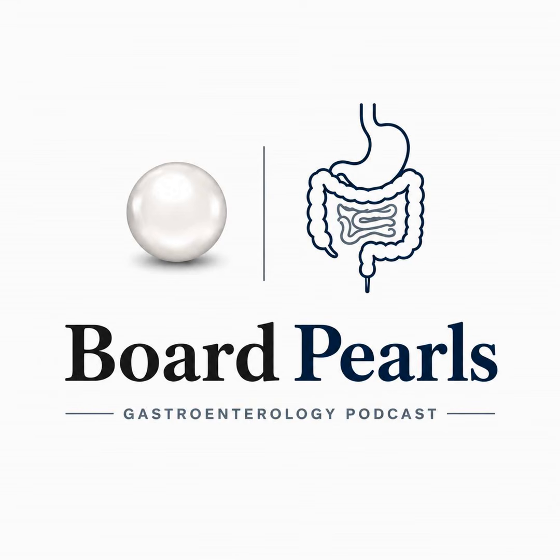Contraindications to capsule endoscopy have softened over the last decade in a way the boards test as a knowledge update. The classical absolute contraindications included pacemakers and implantable cardioverter defibrillators on the theoretical concern of electromagnetic interference between the capsule's radiofrequency transmitter and the cardiac device. Modern capsule platforms like the PillCam SB3 and beyond have been validated as safe in patients with pacemakers and most ICDs. Current ASGE guidance does not list cardiac devices as an absolute contraindication.